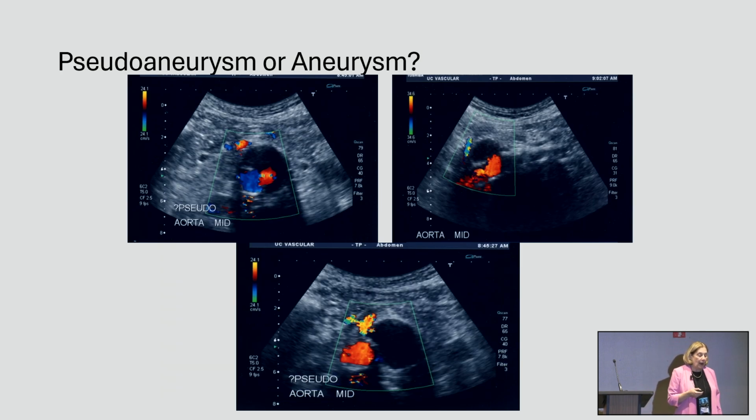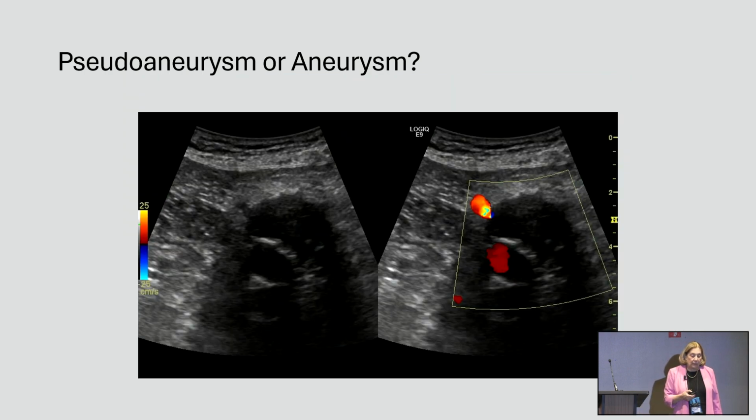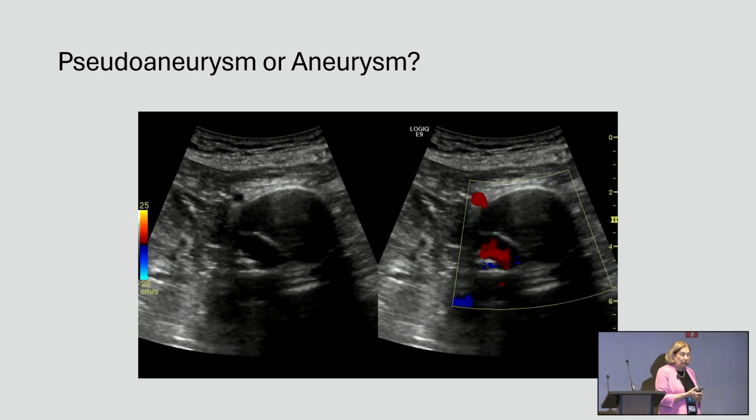But you have to open your eyes, because when you look at this, notice that as we get down to this part, there's a big sacky thing over here outside of where the aorta has color in it. So we brought him back into the main lab, and GE at that time had fusion imaging just starting, so apologies to GE, this is early fusion imaging, it's not as pretty as other things. But watch this. So there's flow in there, and then watch just with the ultrasound.